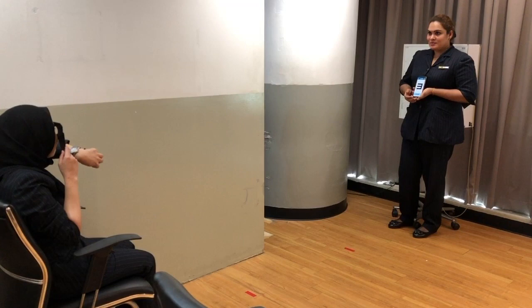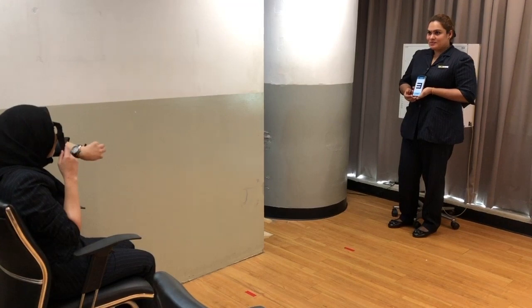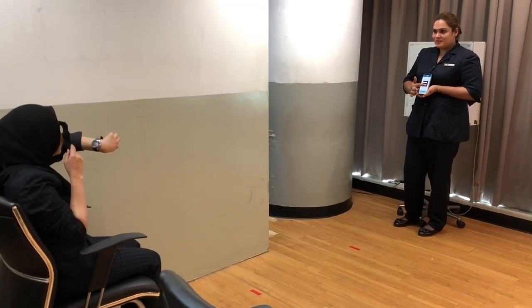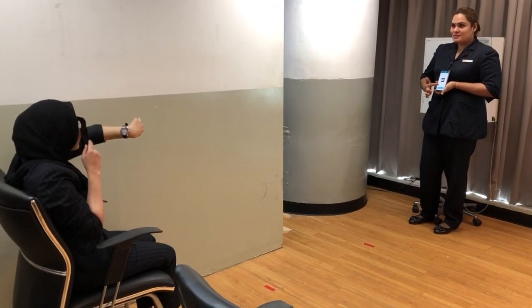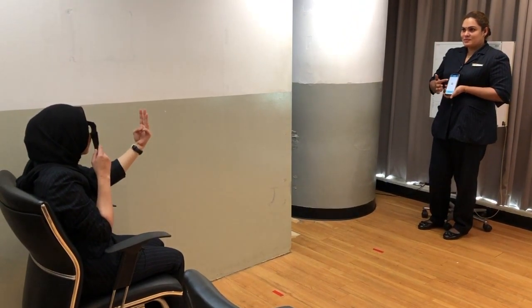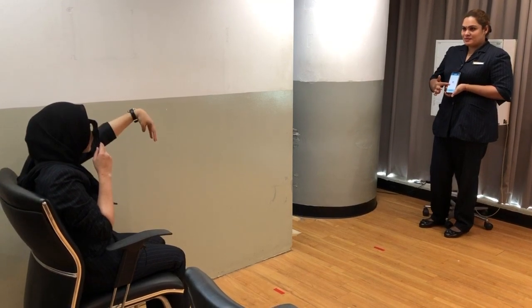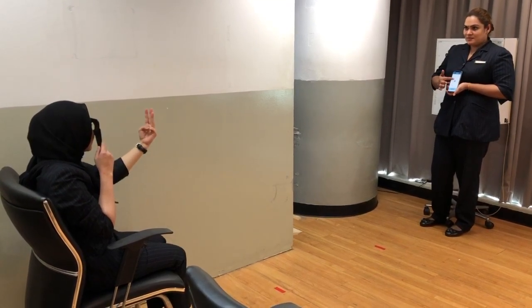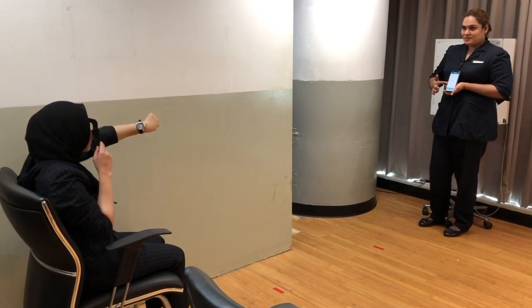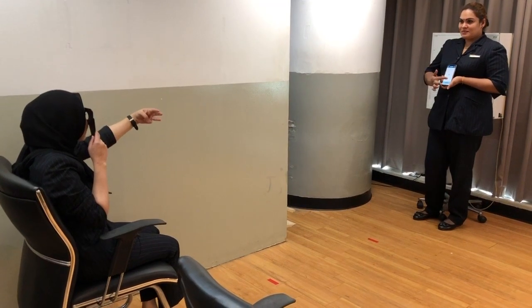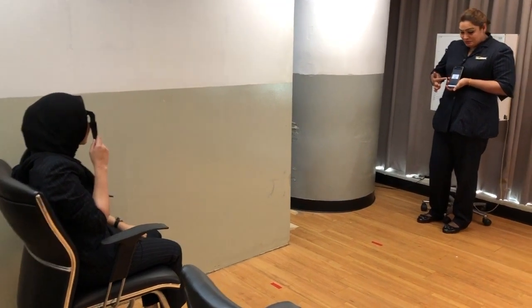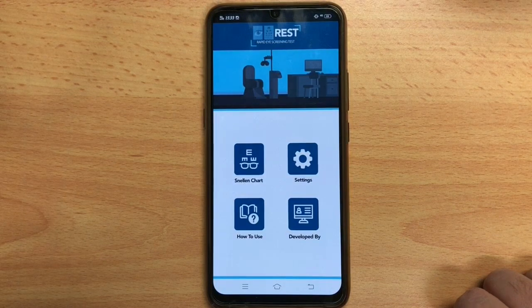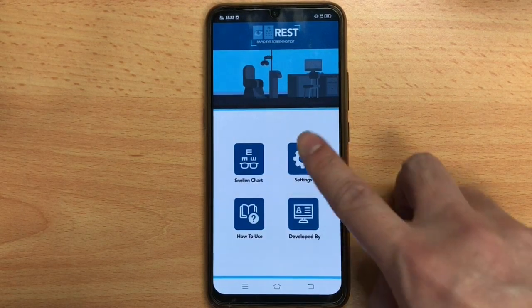This is a sample of the Rapid Eye Screening Test that we're going to use. To use this app, a first-time calibration is required.